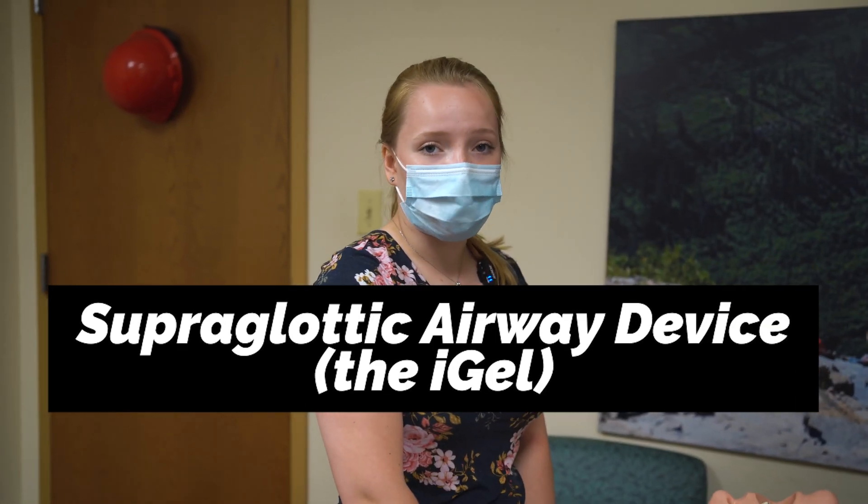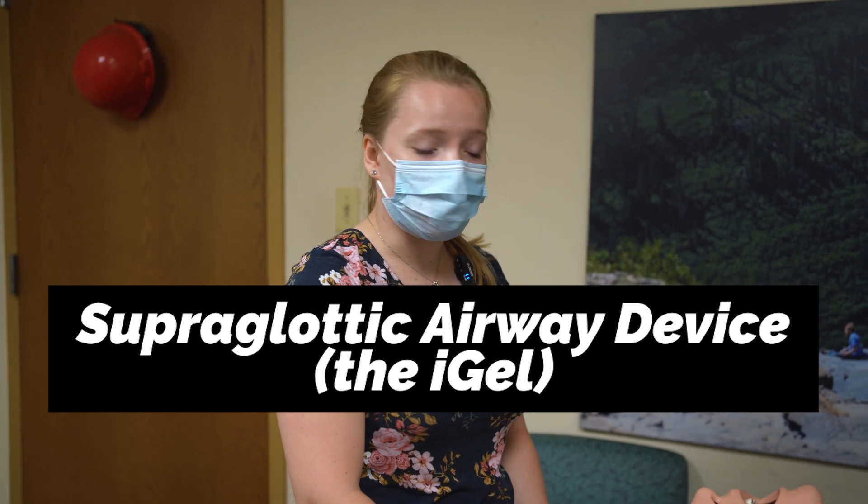Hey guys, today we're going to be managing a patient's airway with a supraglottic airway device. Today we will be using the i-gel.